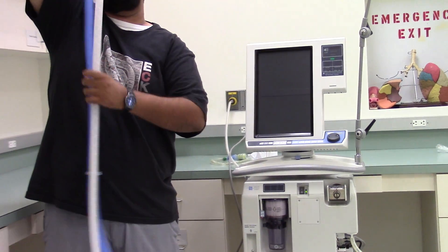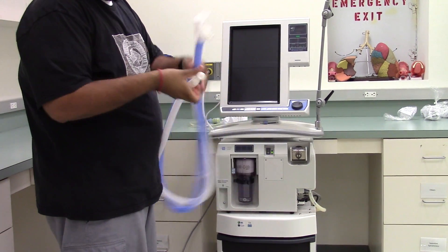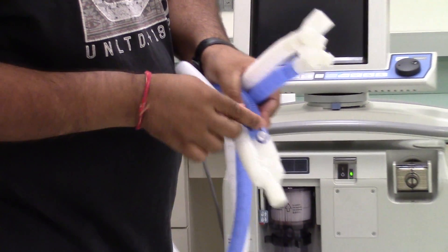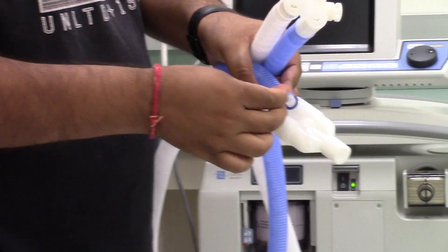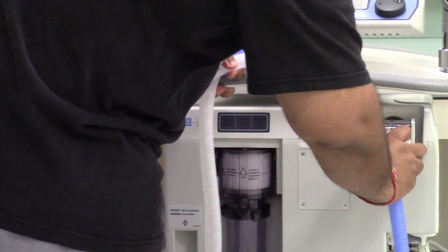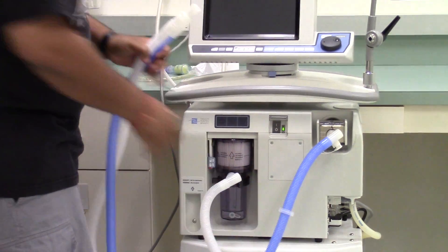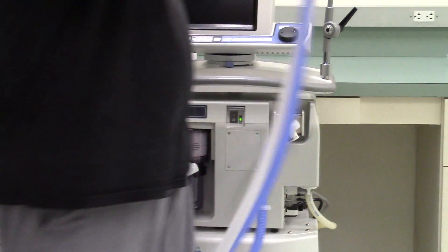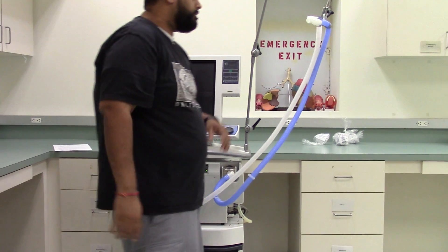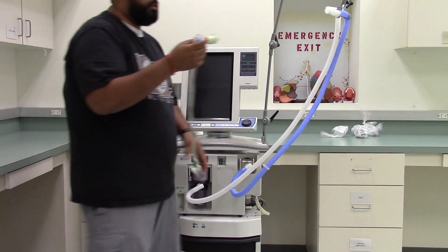This is our Y connector with our inhalation and exhalation tubing. We can identify the inhalation side because of the temperature sensing port. The inhalation tubing goes here, exhalation goes there. We hang our tubing up there, and we have our closed suction and valve on there.